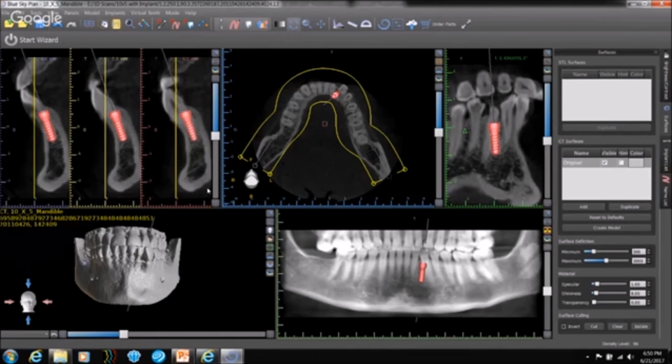Okay. Can you summarize some of the most common mistakes that doctors make when analyzing the CT scan? That's a very good question. The good news is not a whole lot of people are making any mistakes. So that's a great thing.